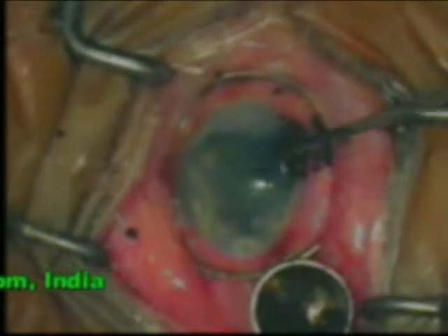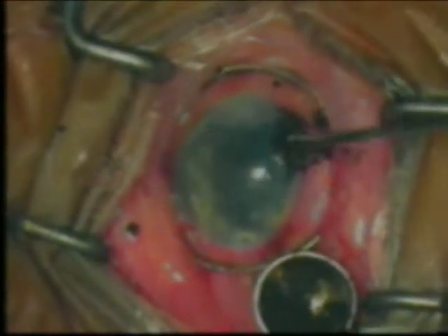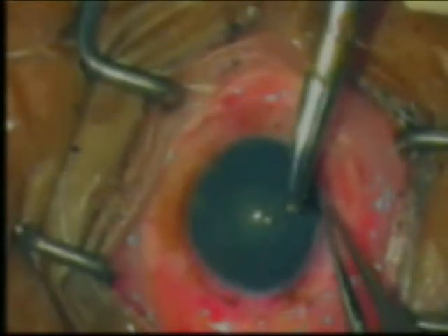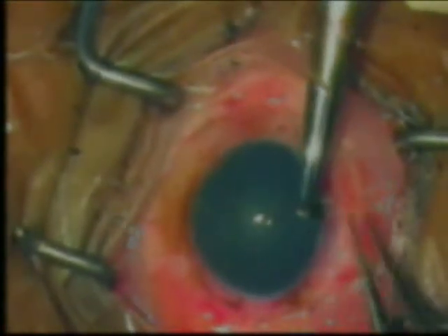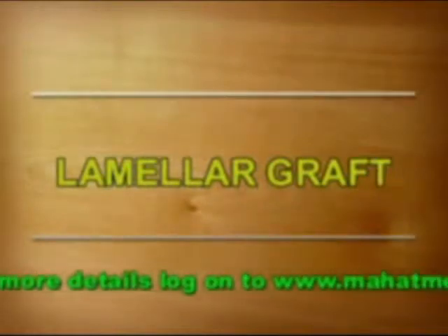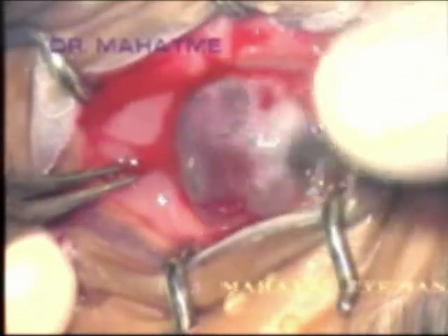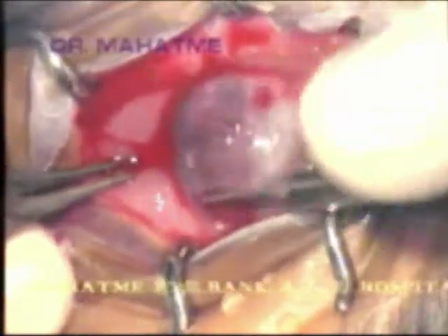After this, the pigment is spread between the superficial and deep corneal lamellae. This incision is then sutured with 9-0 nylon suture. Let's now move on to the lamellar graft technique for tattooing. It is adopted when the opacity is superficial and deep. We scrape off the corneal epithelium over the opacity.